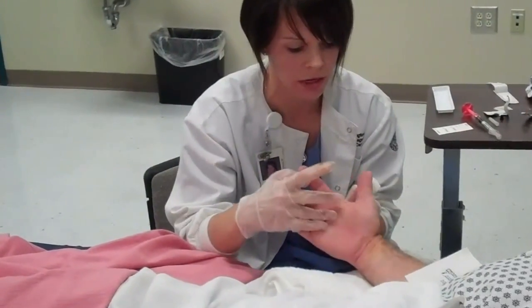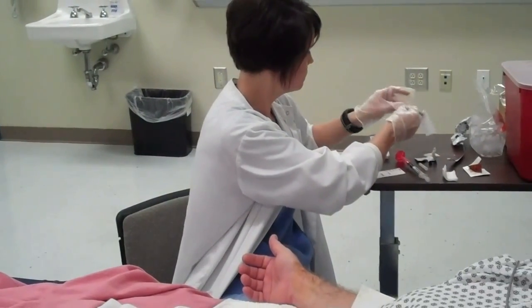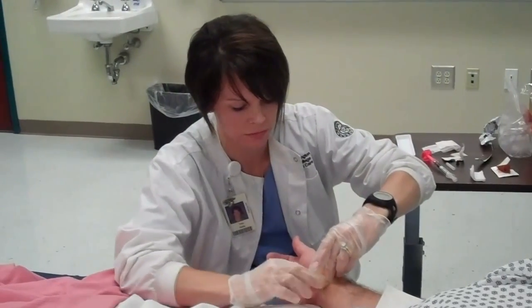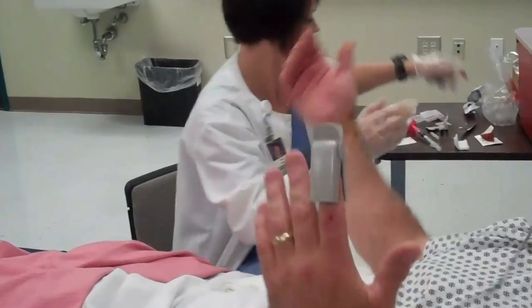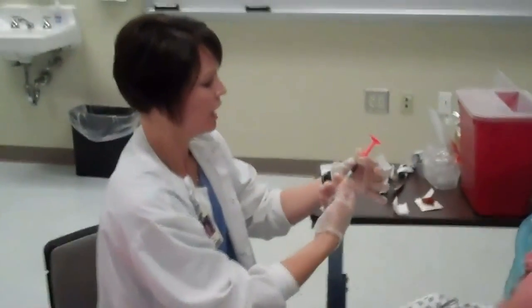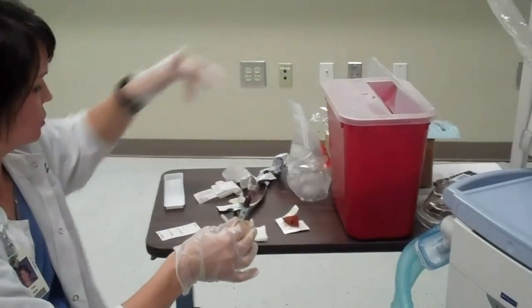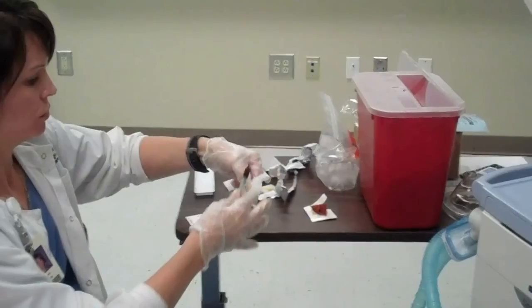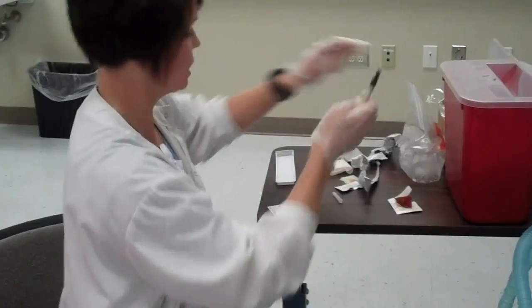It looks good. Take our band-aid and put it here. You're okay? Yes. Didn't even feel it. So at this point I now have my sample. I'm going to take the needle portion off and dispose of that. See if there's any bubbles — pop those out and then put my cap on. I popped out my bubbles earlier, so now I will take my sample.